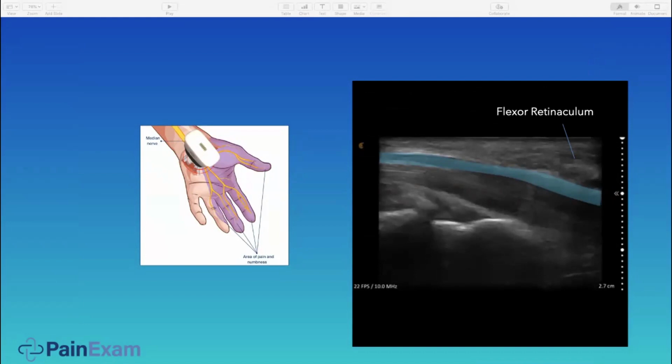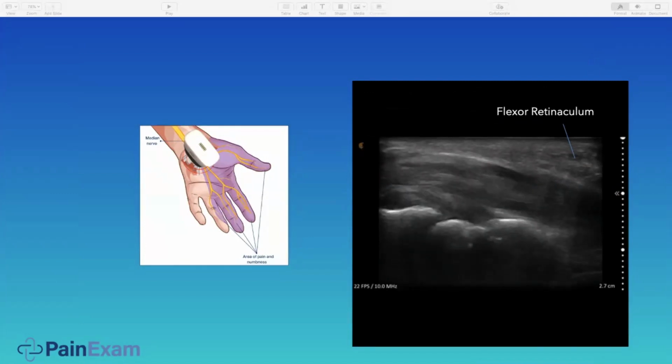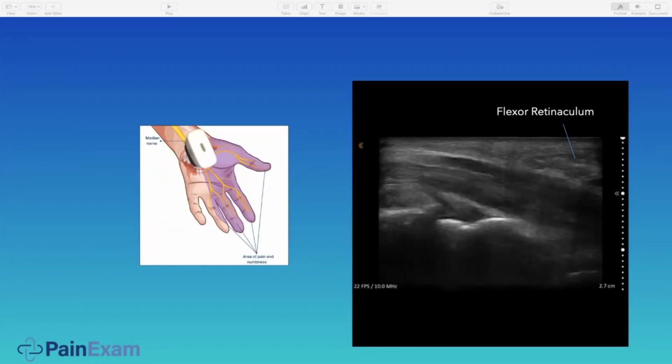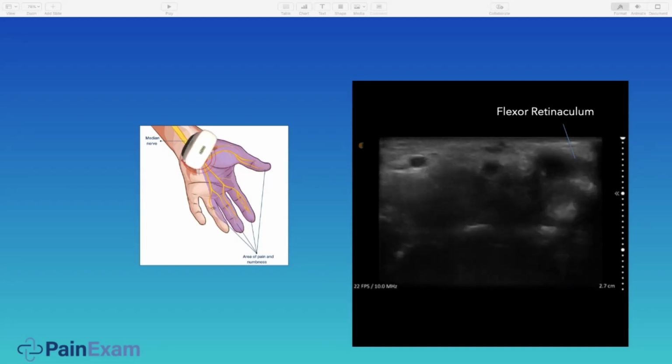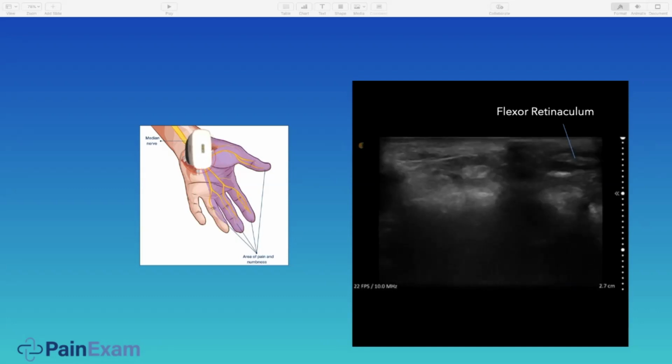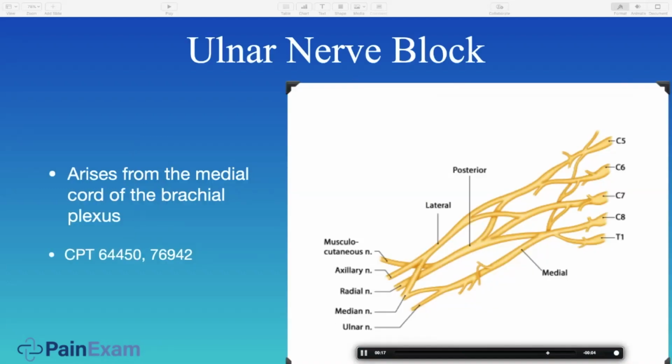Okay, and this is my carpal tunnel, so I maybe should be careful here. And the tendons are moving underneath the nerve as I'm wiggling my fingers. The nerve is pretty much stable, and we're turning the probe 90 degrees to visualize a cross-section of the nerve and turning it back. That's the nerve right there, and then we're turning it back.